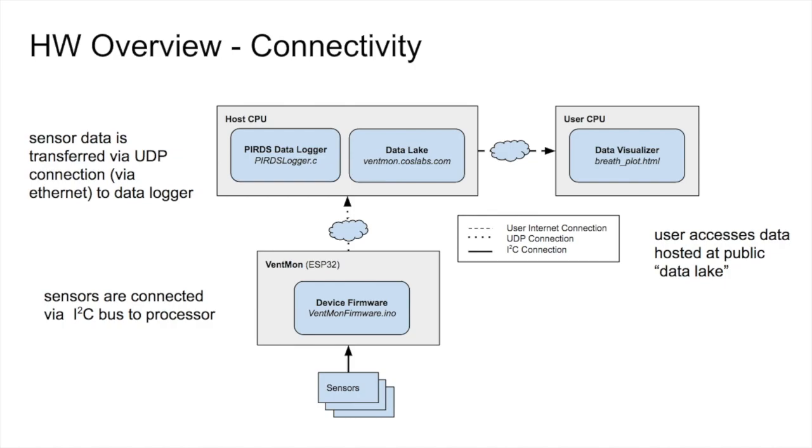That data is processed a bit and then sent via UDP connection to our host, which is running a data logger, and then our server, VentMon.coslabs.com. Finally, a user is able to access that data using their own internet connection and view it in our public data lake.